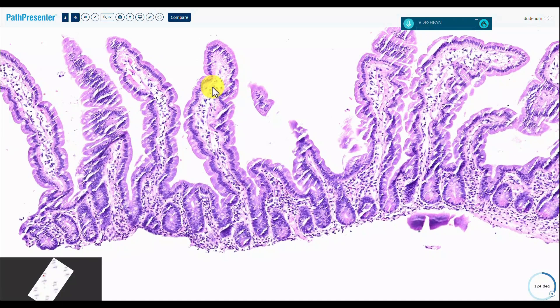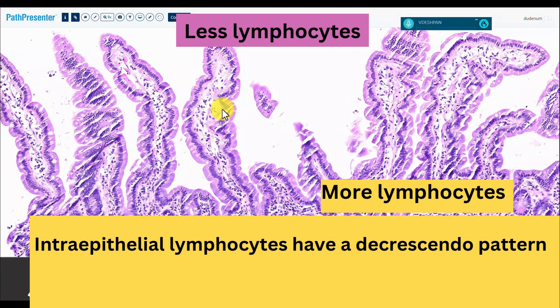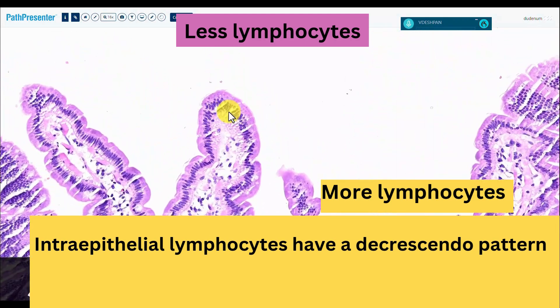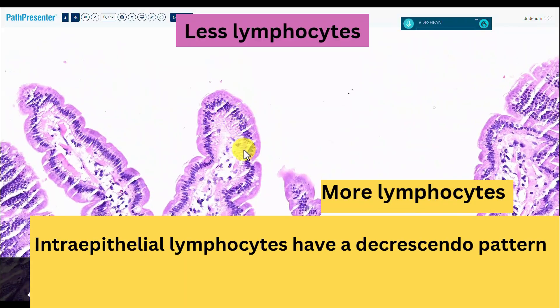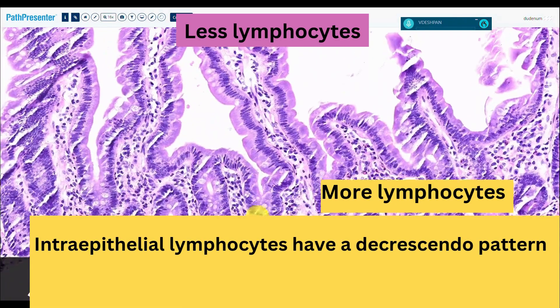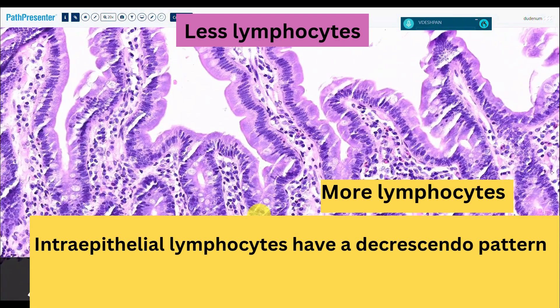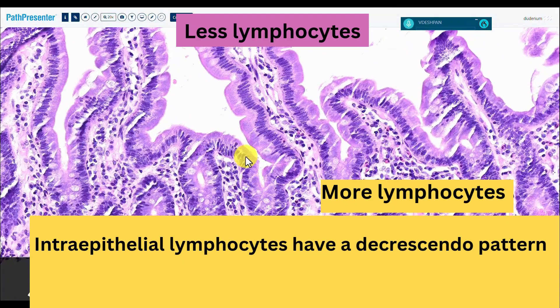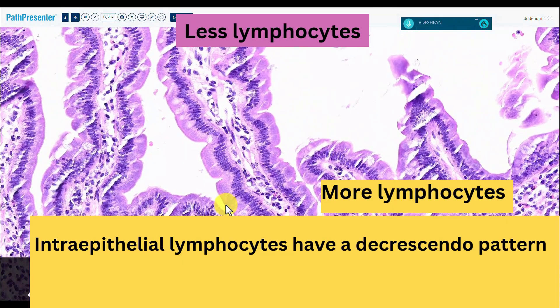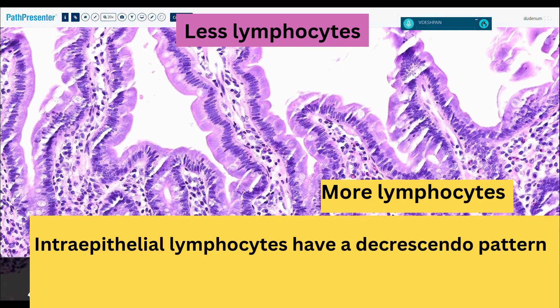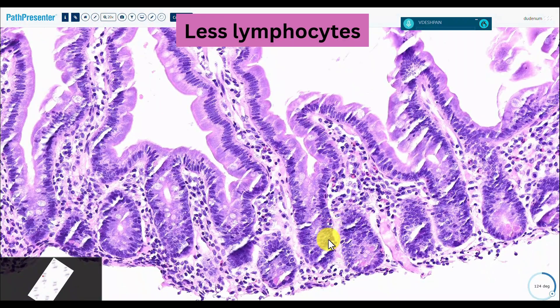One more thing about intraepithelial lymphocytes: in general, the number is fewer at the top, and there are more intraepithelial lymphocytes at the base. So there's this decrescendo pattern of lymphocytes. And here you can see there are very many more lymphocytes at this crypt base.